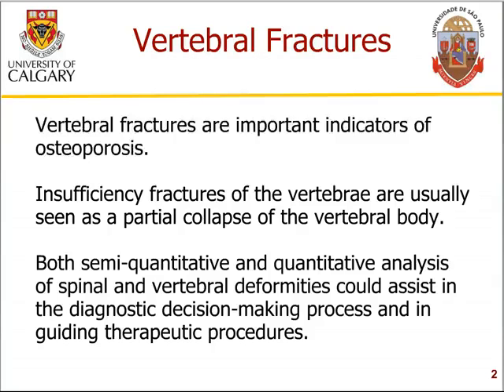In addition to visual analysis of the radiographic images by radiologists, some form of quantitative or even semi-quantitative analysis would be useful in the assessment of spinal and vertebral deformities, including fractures, and could assist in the diagnostic decision-making process and guiding therapeutic procedures.